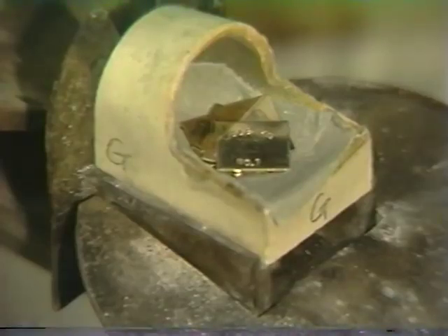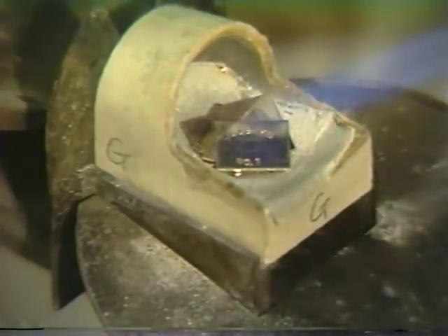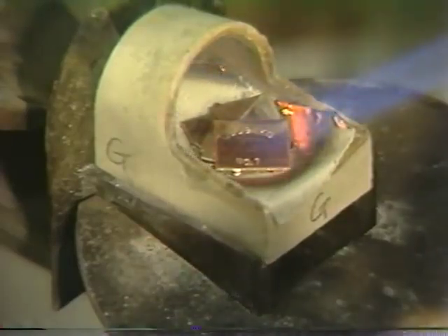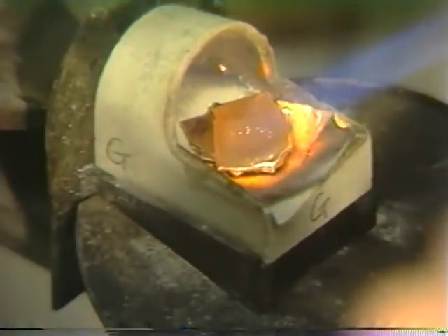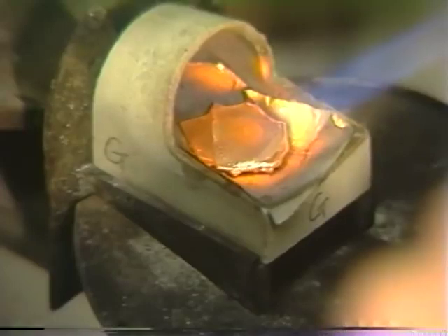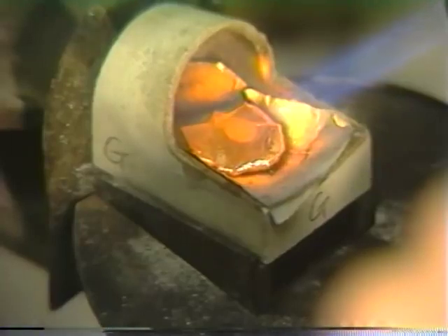The gold has been placed on an asbestos liner to assure a clean melt. A properly adjusted casting flame is used to melt the alloy, directed for the most efficient heating rate. If you see a black dot you're too close, so back off a little and utilize the reducing portion or the blue tip of the flame to get optimal efficiency.